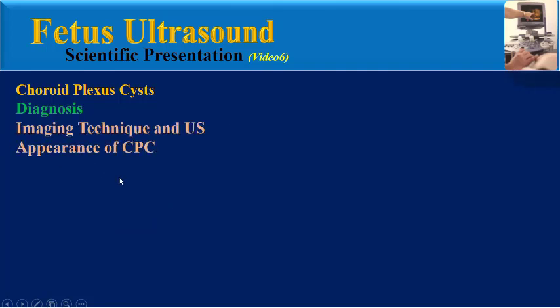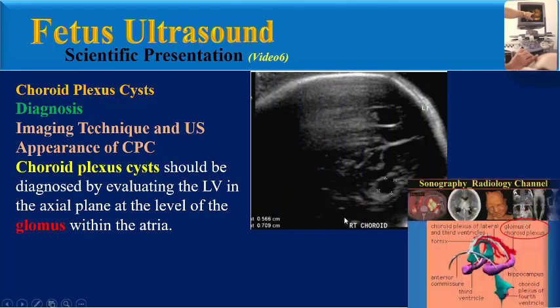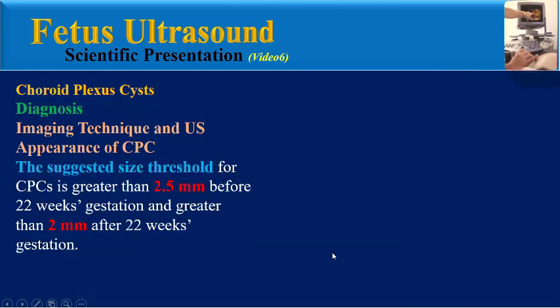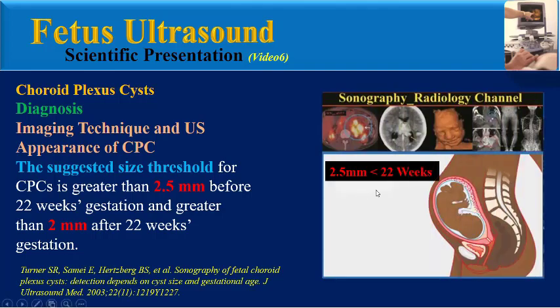What is the imaging technique and ultrasound appearance of choroid plexus cysts? Choroid plexus cysts should be diagnosed by evaluating the lateral ventricle in the axial plane at the level of the glomus within the atria. A true cyst appears as a spherical sonolucent structure surrounded by the echogenic choroid plexus. The suggested size threshold is greater than 2.5 mm before 22 weeks of gestation and greater than 2 mm after 22 weeks.